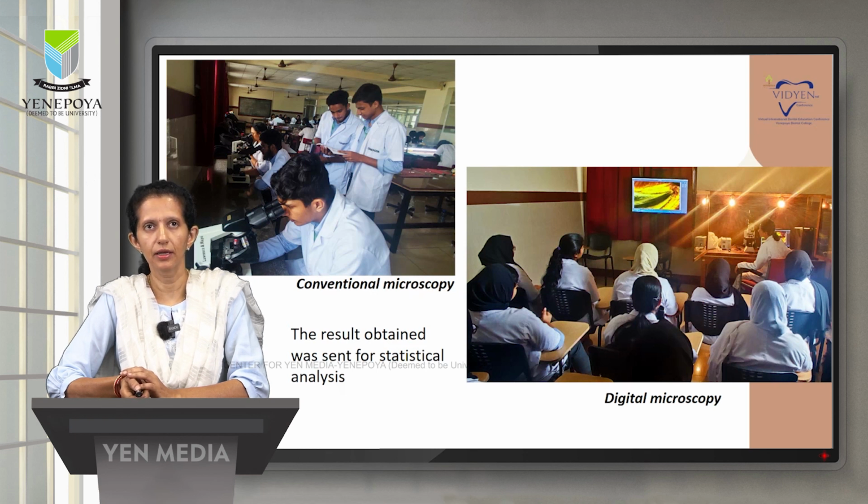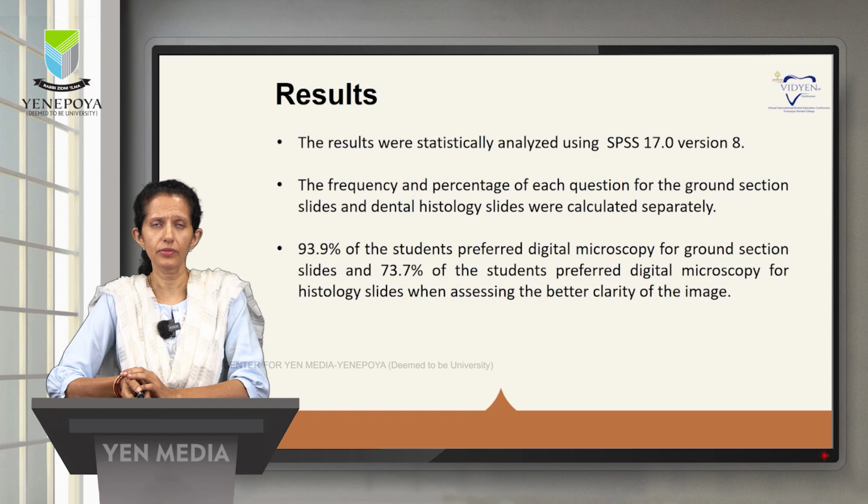In the picture you can see the students interacting during the digital microscopy and the conventional microscopy. The results were statistically analyzed using SPSS version 17.0. The frequency and percentage of each question for the ground section slides and the histology slides were calculated separately.